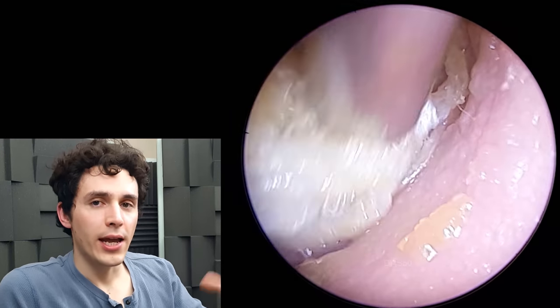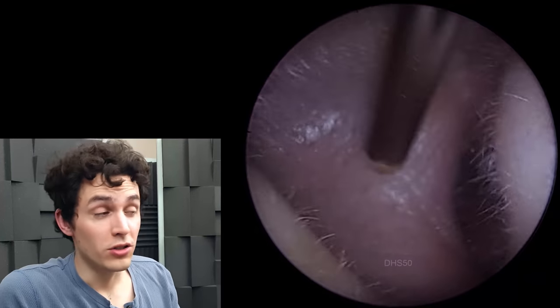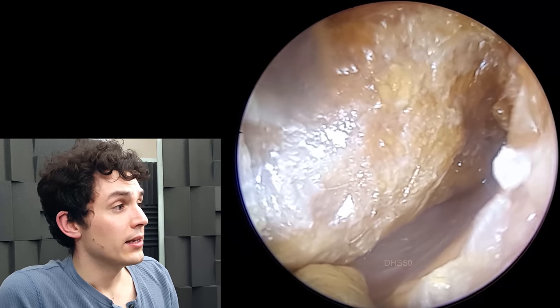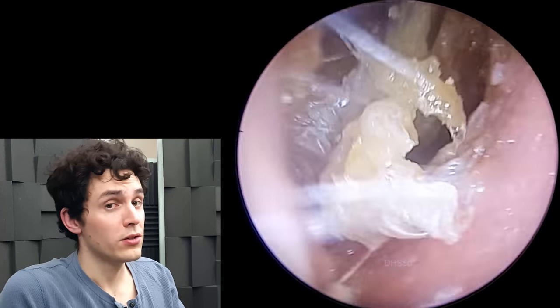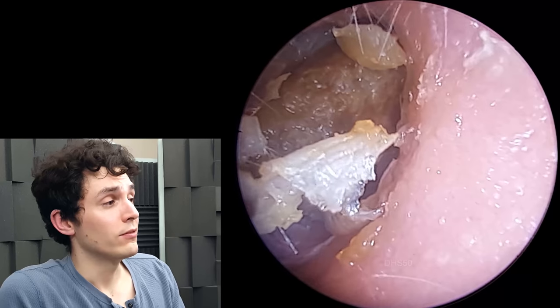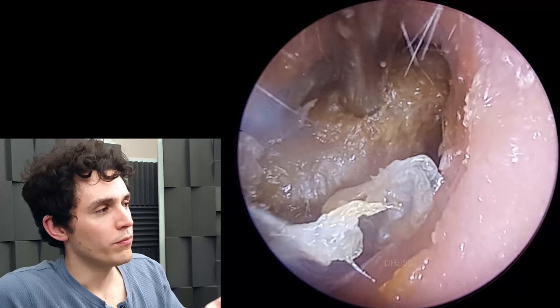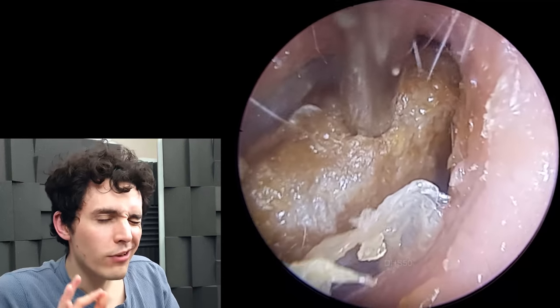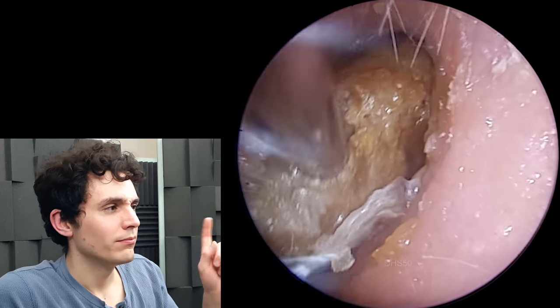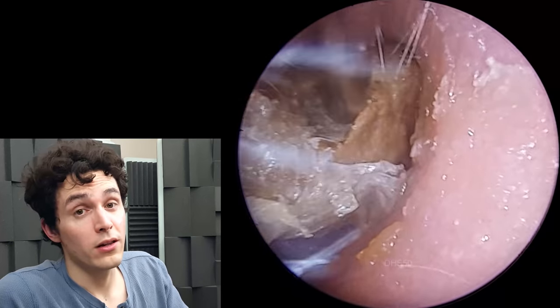So we're going to have to employ a few techniques here. A lot of you have been asking me in the comment section to showcase some of the different tools we have in the clinics, perhaps the more obscure ones. This happened to be a case where I used a Formby scoop. A Formby scoop is a metal instrument — I've never seen a plastic one. You have a loop on one end, similar to a Jobson horn, but the loop is more of an oval shape and fractionally larger. On the other side you have a pick or a blunt spike, which I very rarely use — if I need that type of tool I'll use a Rosen inserter.